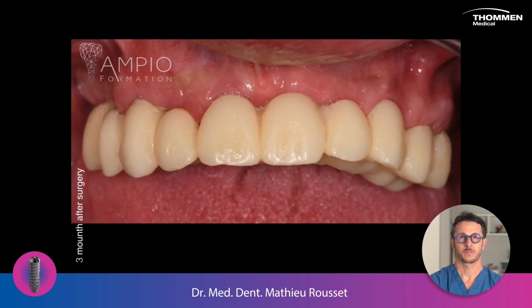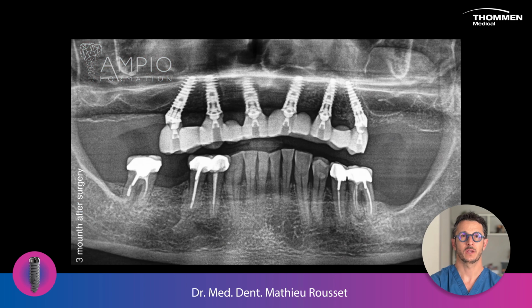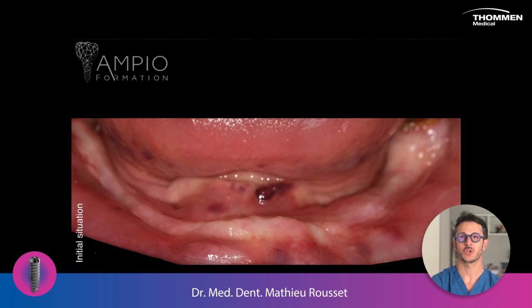After 3 months, we can see a good cicatrization, healthy tissue, and on the X-ray you can see the good position of the bone. But the implant can also be used in situations where the bone density is high. I will quickly show you a case of an all-on-4 in the mandible with a type 1 bone.